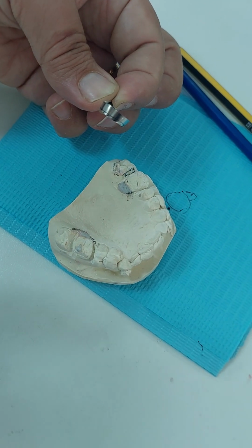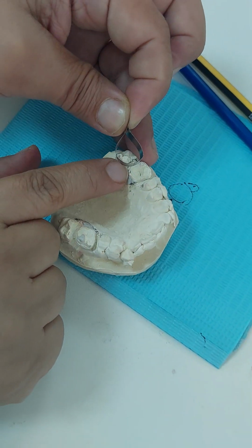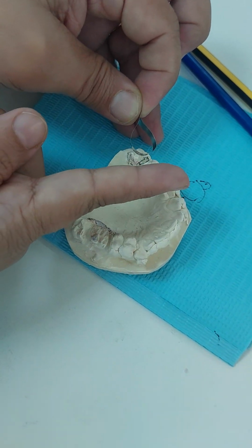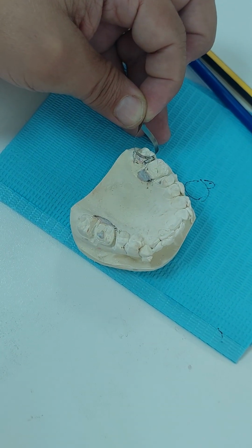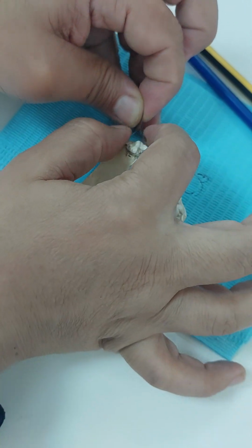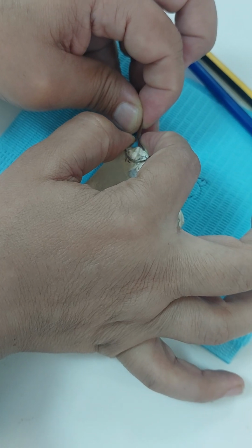These are the ones, the most important 2 millimeters in the whole filling, because these are the ones that need moisture control. These are the ones you want to control the emergence profile. These are the ones that you want to put a good wedge if you're going to. Sometimes you might even not need a wedge here, because it's totally fit. Because the way I cut it, it becomes grasping by itself. It goes into the undercuts of the tooth.